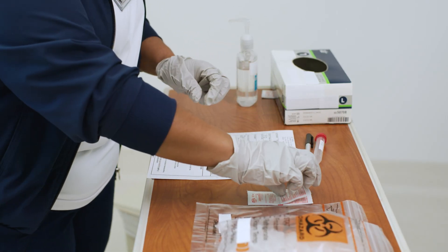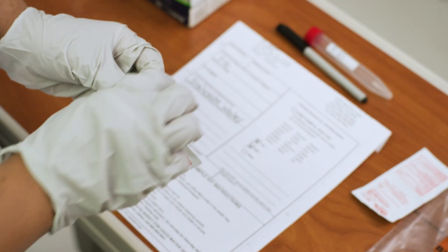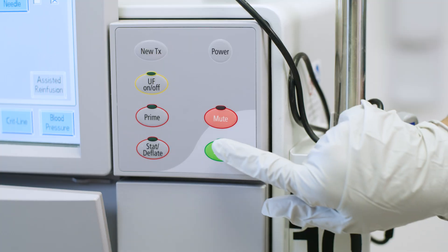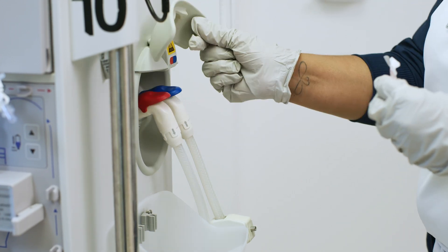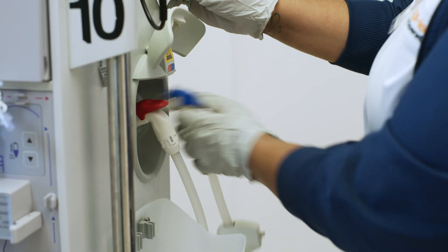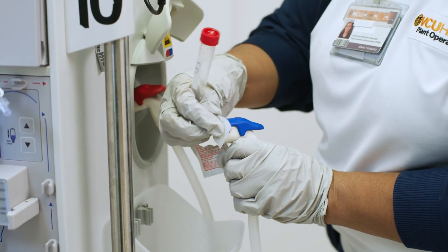Samples will be collected from the outflow side of the dialyser or the sample port inlet dialysate line. Machines can vary, so always follow the manufacturer's instructions for testing and use. Lift the cover and remove the outflow hose. Using the alcohol wipe, disinfect the opening of the port for five seconds and let it air dry.